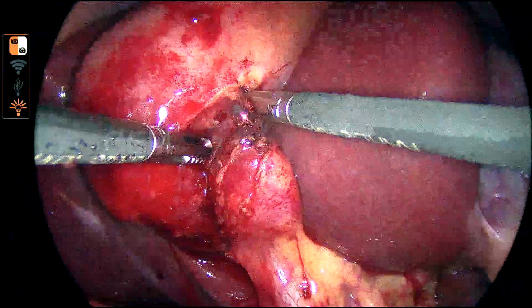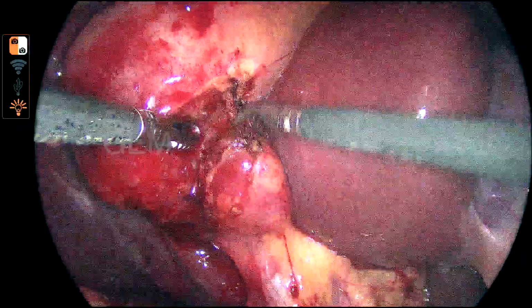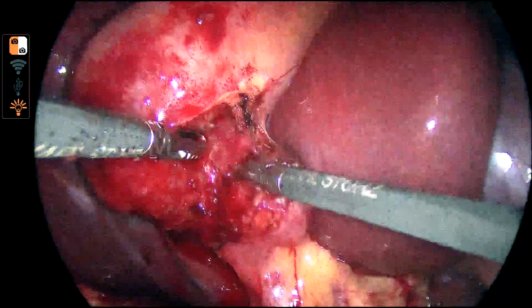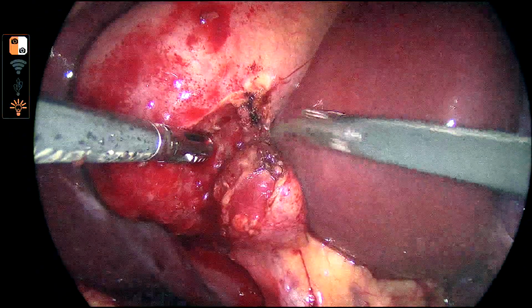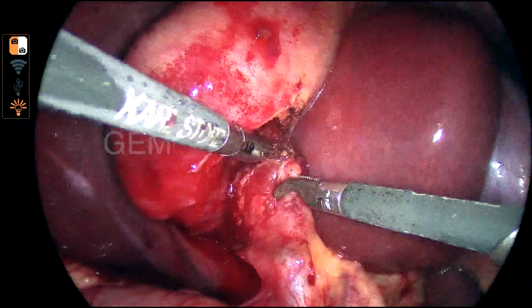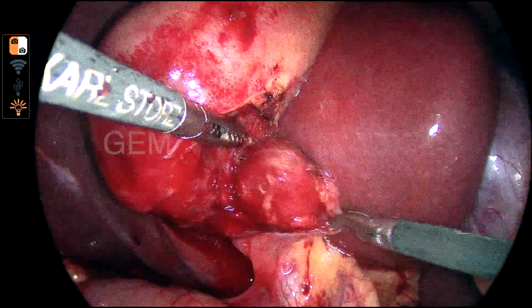I want to ligate the cystic artery first before going for the cystic duct, because the cystic duct is covered with multiple small arteries, called arteries of Calot's. These are small arteries coming from the cystic artery to the cystic duct. So, I am trying to mobilize the node. I can't hold the node. Once you hold it, it starts to bleed.